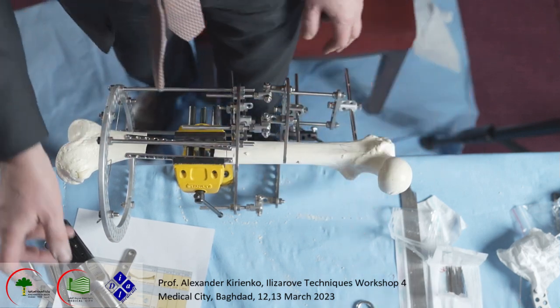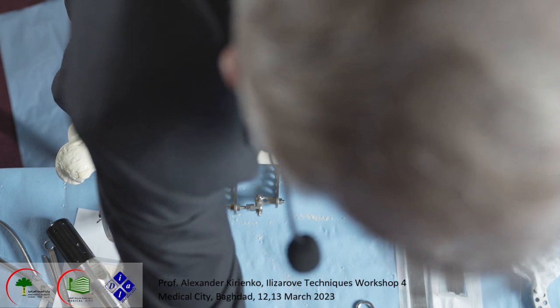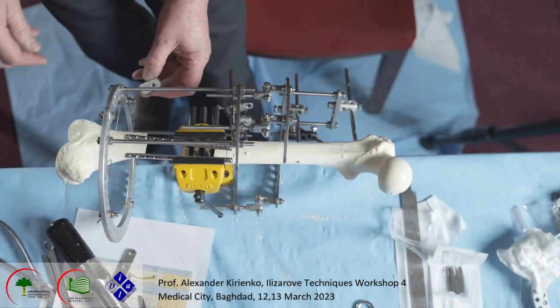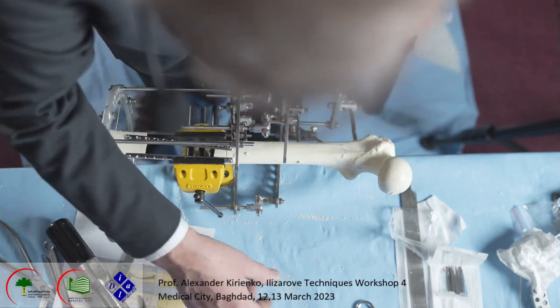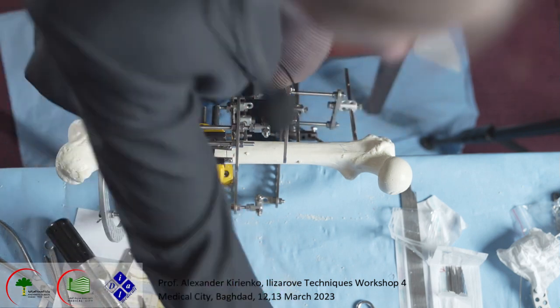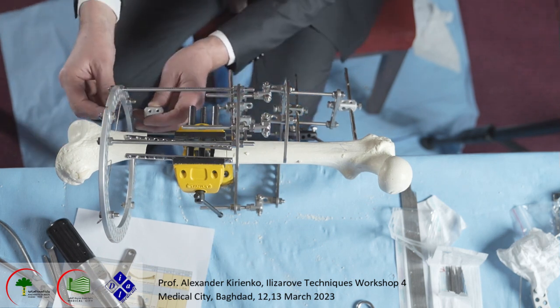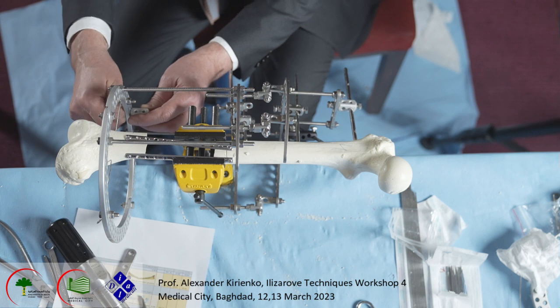Okay, we use this and this, maybe lateral. Now we use a 2-hole post here. This lateral half pin should be done from posterior.